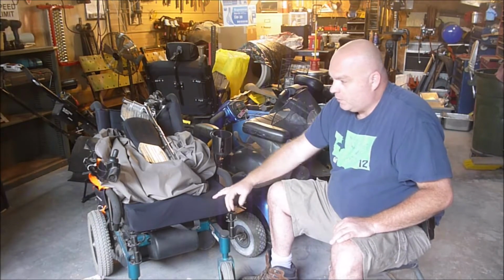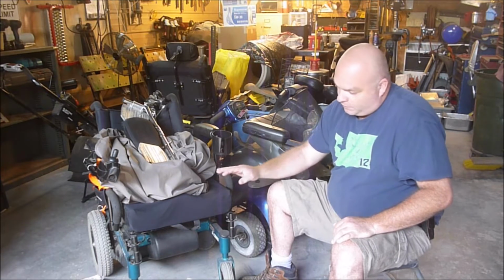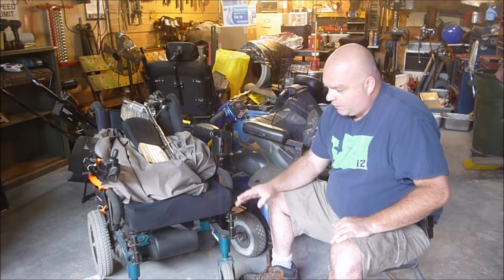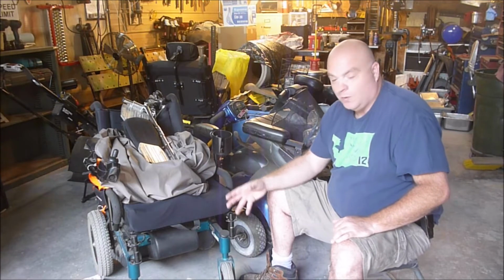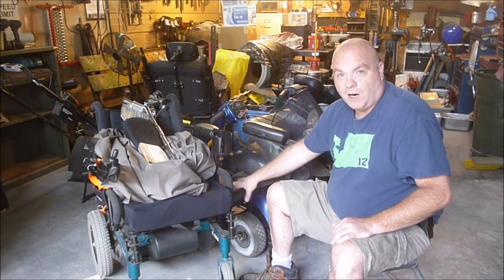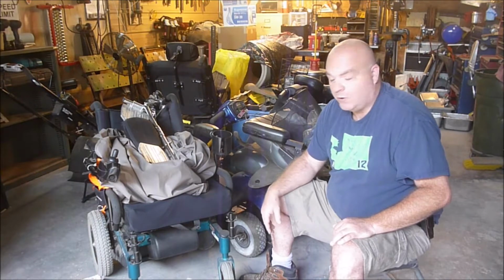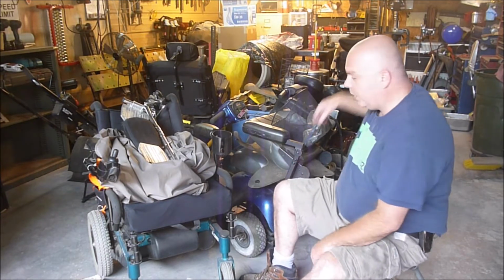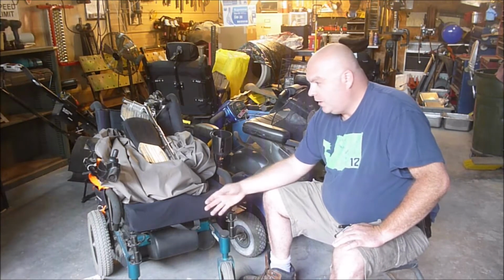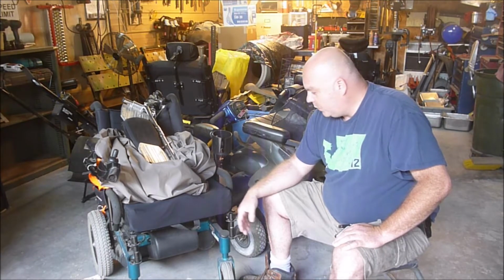So we went ahead and got a good deal on this. This was a friend of ours, and his son needed wheelchairs, and they had two of them, and I chose this one because it was a little beefier than the other one. It has bigger tires, so it definitely goes in gravel and dirt a lot better, and I knew that's some of the areas I'd bring my chair. The other one was more like some of these other ones I'll show you later. Anyhow, he got a good deal on it, and he threw that deal back to me, so I got a really good deal from a friend.